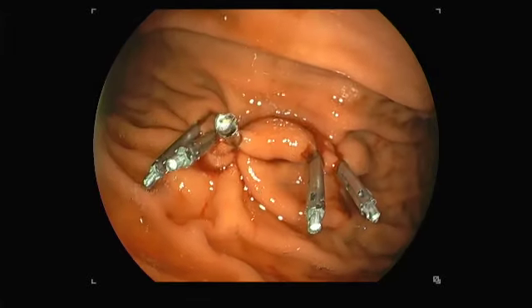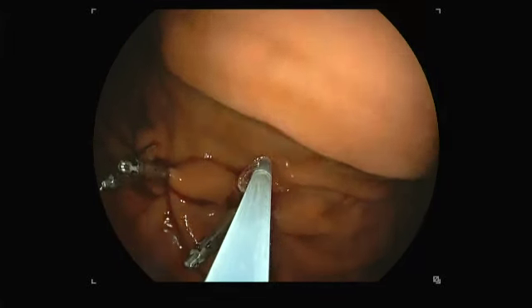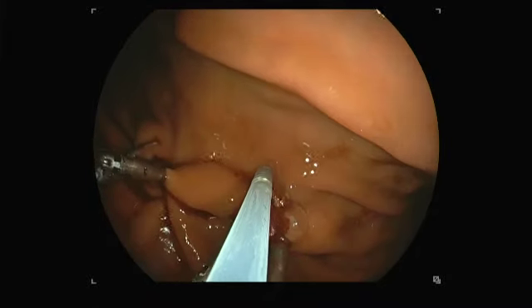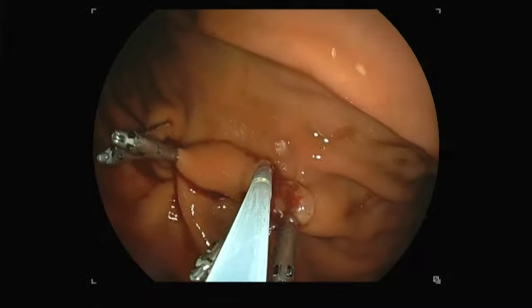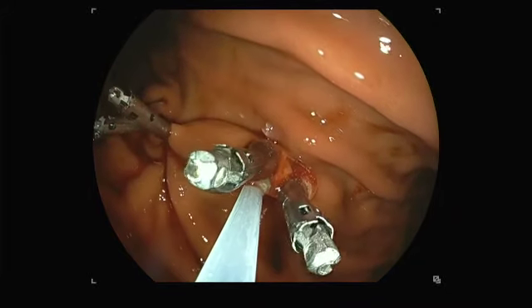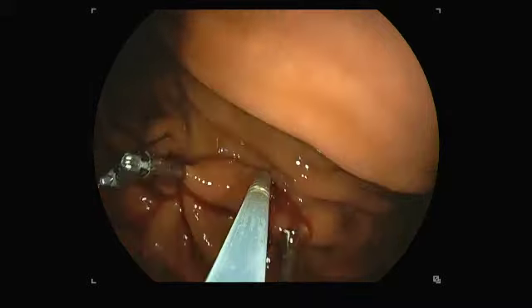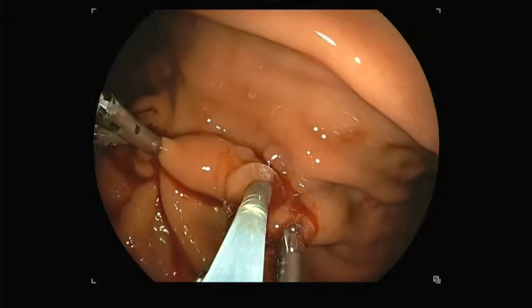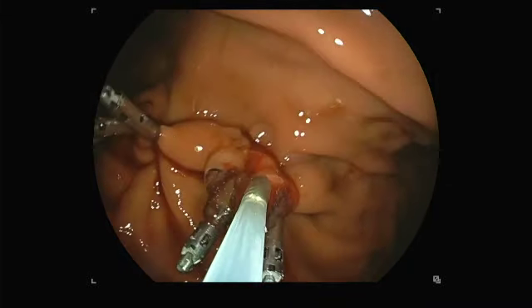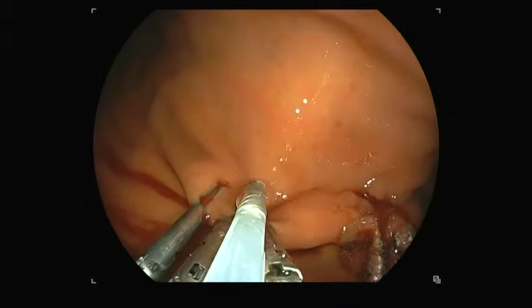So we decided to put one more clip distal to the second lesion, and then before we came out, we thought, why not apply a little bit of Purostat. This has been shown to stop bleeding as an additional way of creating a firm clot quickly, given the low platelets that the patient has been having.